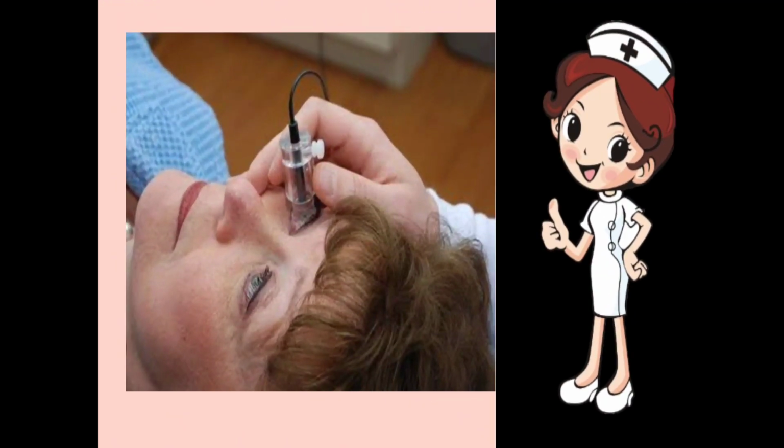Ask the patient to look at the ceiling. In this probe, a red light will appear at its tip. The patient is supposed to look at the red light, then the macula will be placed properly in that position where we are going to take the readings. If the patient looks at the red light, then automatically the readings will come. In this way we will take the readings of the axial length easily.